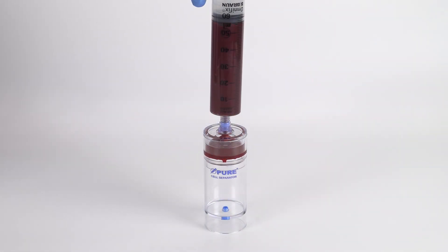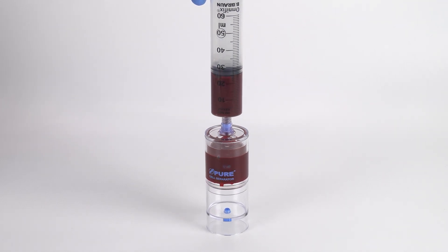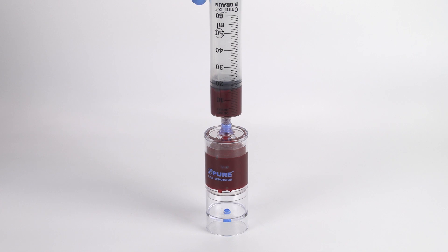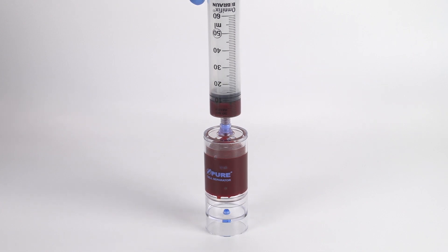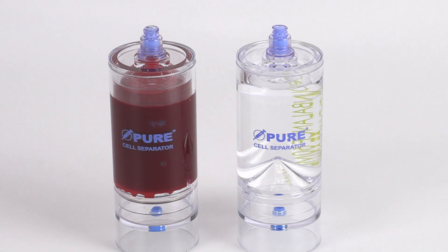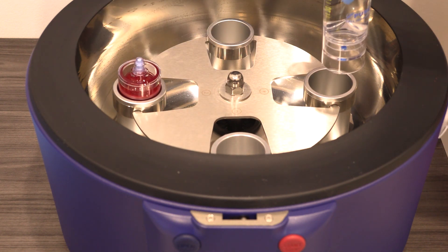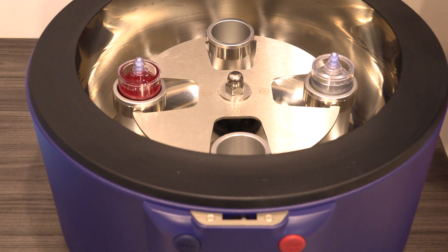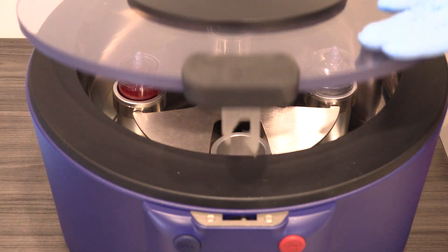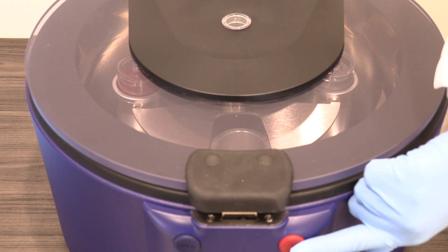Attach the 60 milliliter bone marrow syringe to the needleless port and slowly inject into the separator device. Use the counterbalance device to counterbalance with equal volume. Place both devices in the centrifuge rotor at opposite ends. Follow the protocol settings provided in the Pure BMC2 IFU insert.